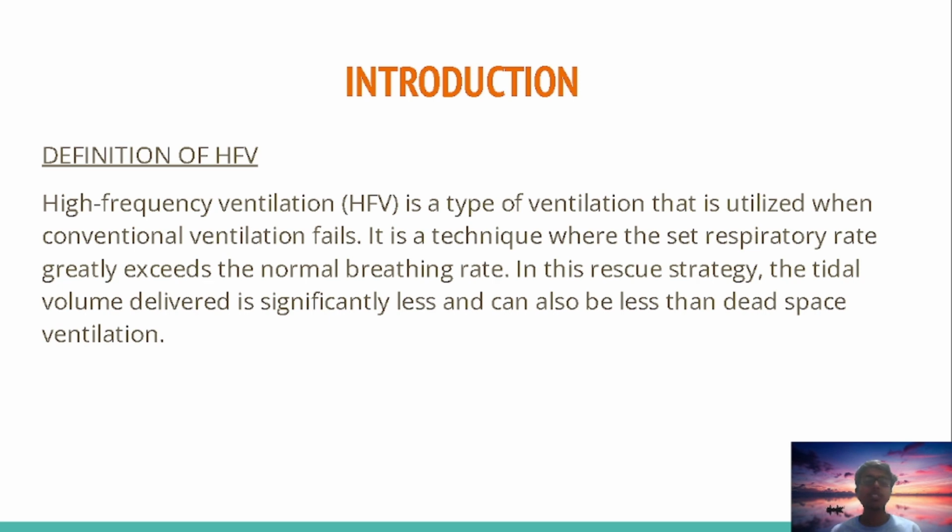So here what they are saying is that high frequency ventilation is one type of ventilation. When conventional ventilation fails, when mechanical ventilation fails, that time this technique will be used. They set a respiratory rate that exceeds the normal breathing rate, so it will be more than the normal breathing rate. In this rescue strategy, the tidal volume provided is significantly less and also less than dead space ventilation.